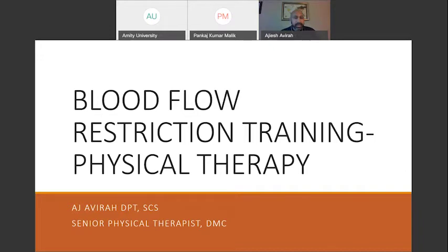We are here to talk about blood flow restriction therapy. It is a form of treatment that originated in Japan in the late 1980s and 1990s, which was introduced to United States military physical therapists in the early 2000s. They did a lot of research in this area, initially on veterans with salvaged limbs, people coming back from the Iraq war. Because of landmines and blasts over there, there were a lot of amputees. They initially started using blood flow restriction for them as an analgesic, a painkiller.